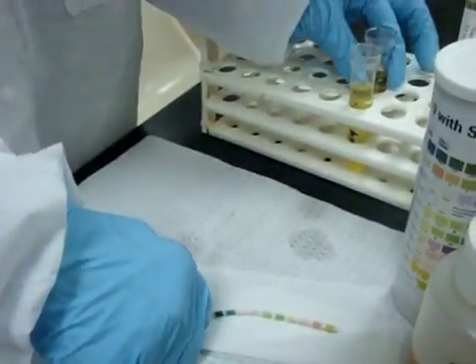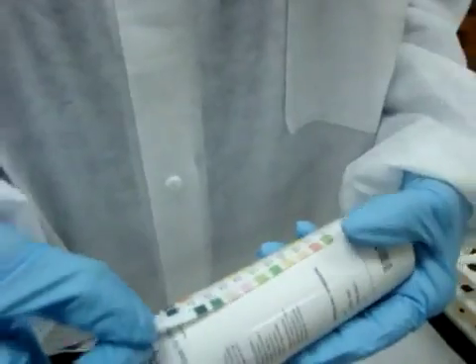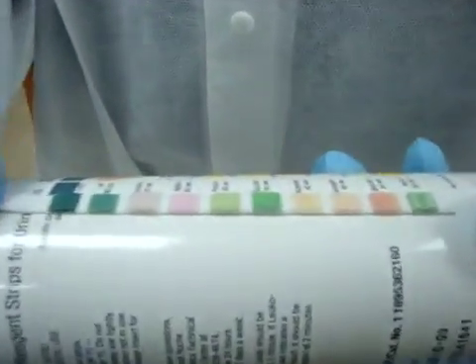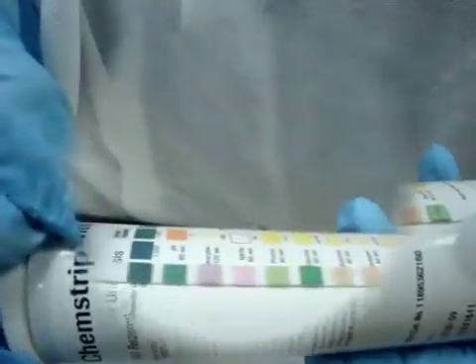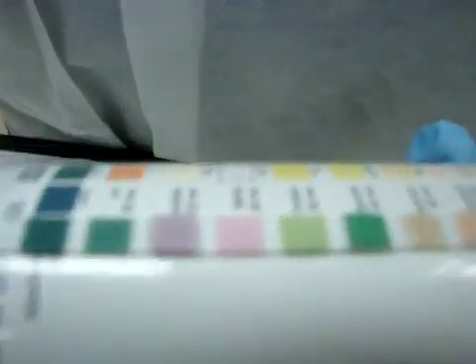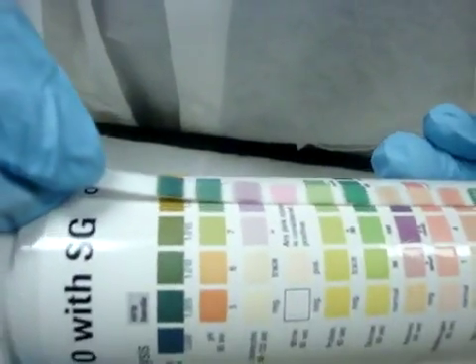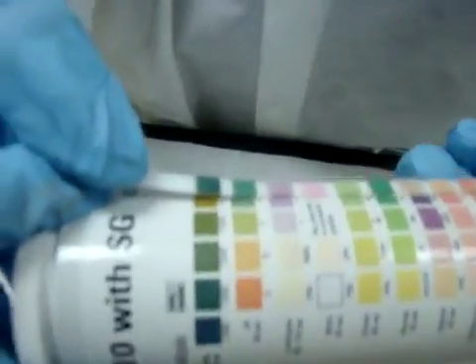We'll put this directly into the urine, drag it along the edge, blot off the excess liquid, note the time, and then be prepared to read. You can see these are coming up really quickly, but timing is critical, so we don't read them until it is time. 60 seconds has elapsed, and now we can read. Again, we do not read our specific gravity, but our pH is going to be a pH of, it's closer in color to 9 than it is to 8, so it's a pH of 9.